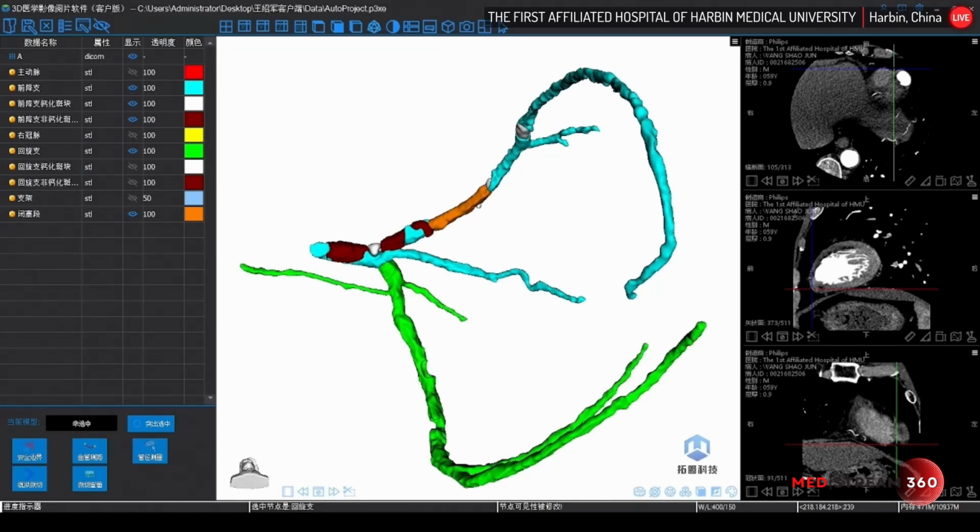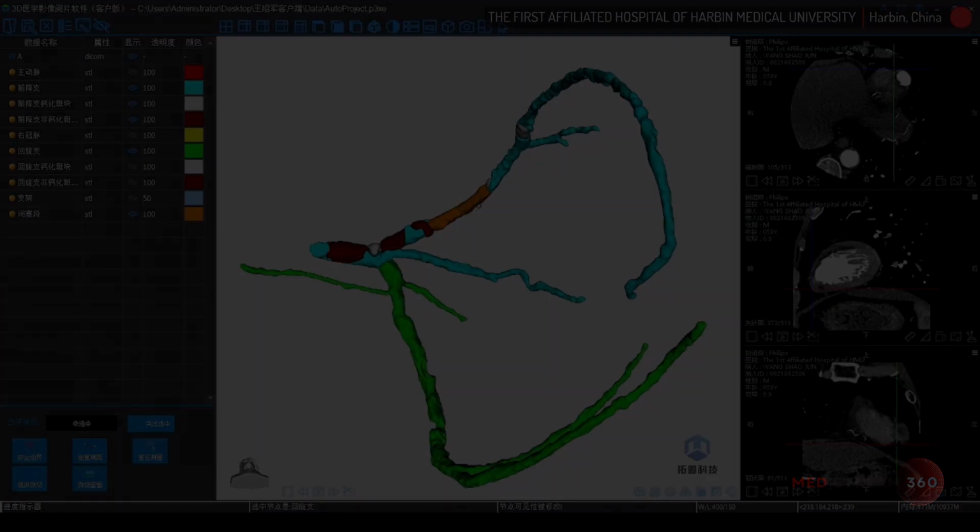The plaque composition is mostly fibrotic, with mild calcification at the ostium of the LAD. We also know that this kind of CTO with a bifurcation has a very high risk of failure from the antegrade approach because there are some patent side branches.